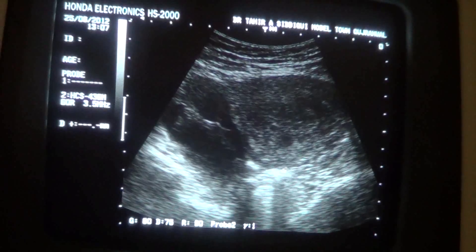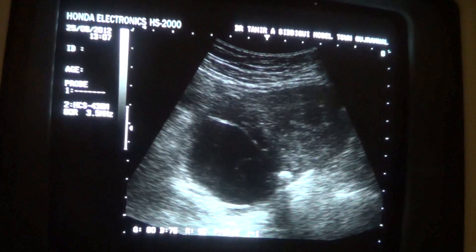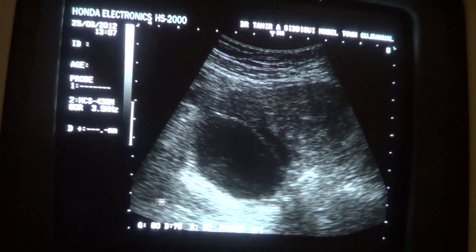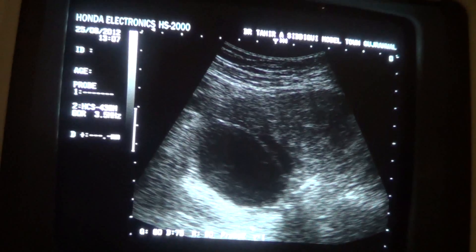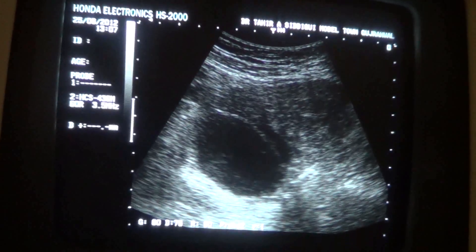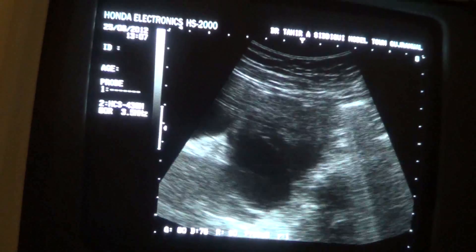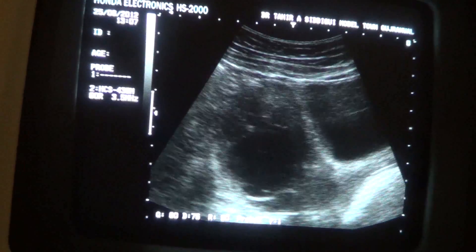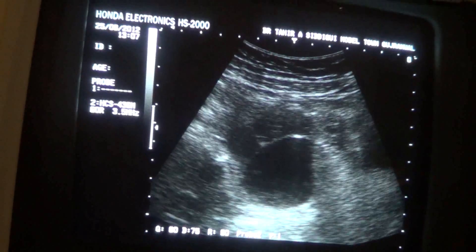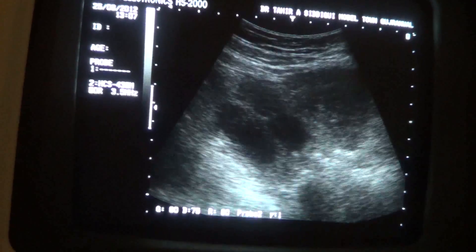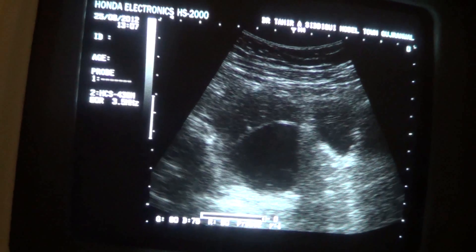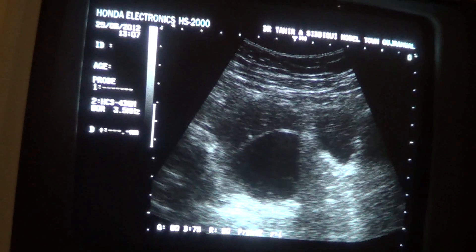There is no posterior wall acoustic shadowing. When I say this is a cyst, note the degree of acoustic enhancement is strong posterior to this cyst. The cyst is thin-walled and does not change its shape while I am giving a sweep to the probe. Note that it is posterior acoustic enhancement and it persists.